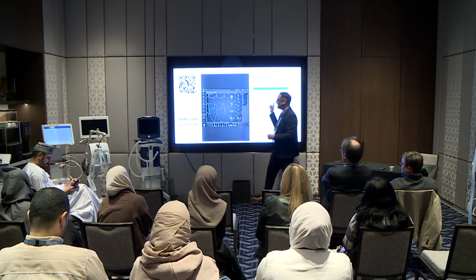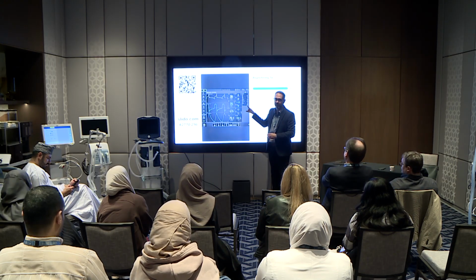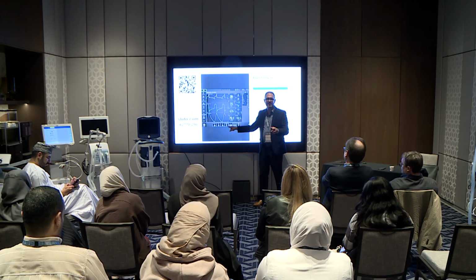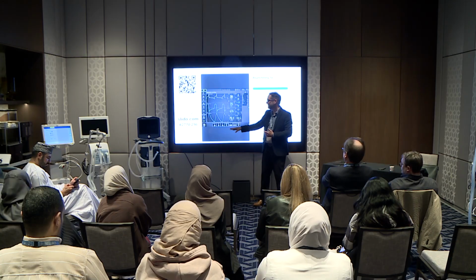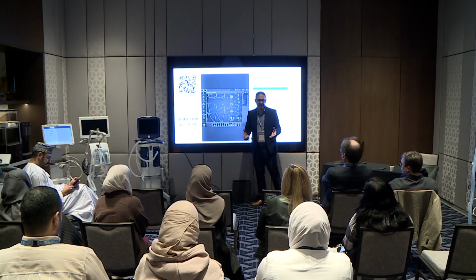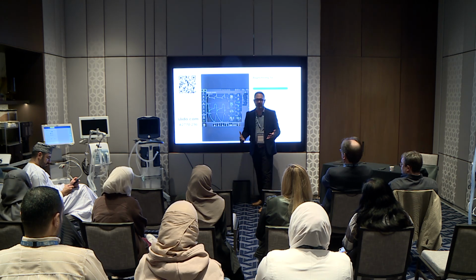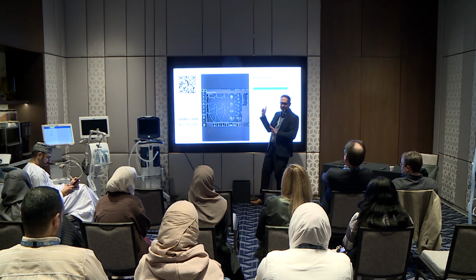This is why, if you chose under assistance, it might be because I pointed out the fact that they're under supported. So this is kind of both. They're only getting 6 centimeters of water. I explained why we couldn't go up. It's already 10.5 mils per kilo in an ARDS patient with a very high drive. So yes, I would argue they're being under assisted, but to properly assist them, I would have to give them a ridiculous amount of tidal volume because the drive is so high. So you're not wrong if you chose under assistance.